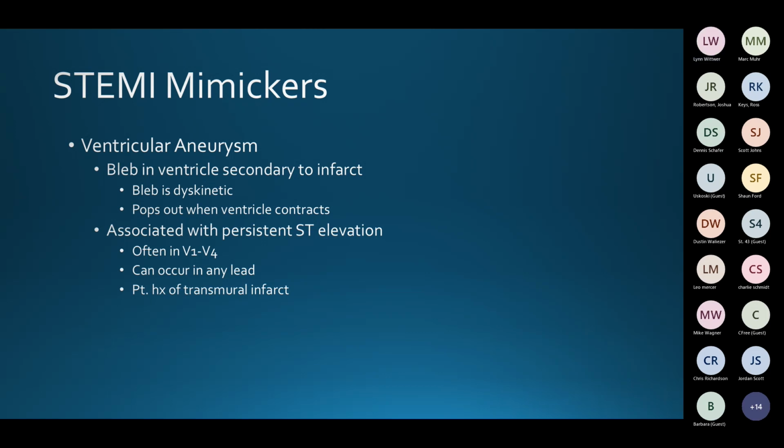after the myocardial infarction, when it should disappear. So you have a history of MI, the patient is discharged from the hospital, complains of chest pain again, or complains of something that brings the medics out, and then you do the 12 lead and you see ST segment elevation, and you say, oh, he's having another myocardial infarction.